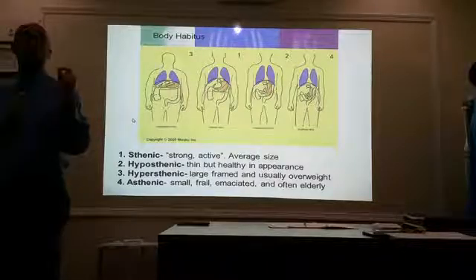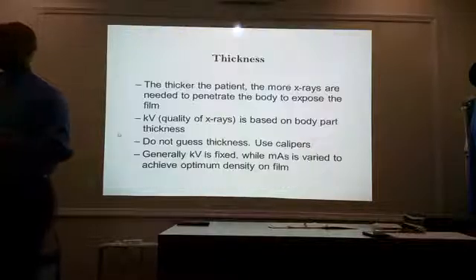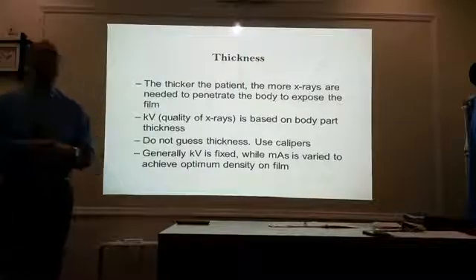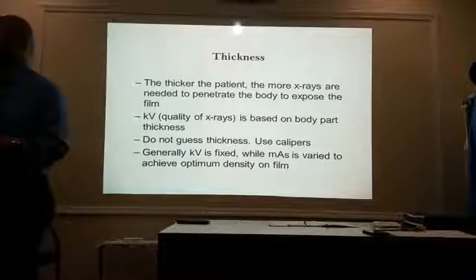Where you're going to direct your central ray, or the center of your x-ray beam, to the body part. We already talked about thickness, right? kV is generally based on body part thickness. The thicker the body part, the more kV we're going to apply.